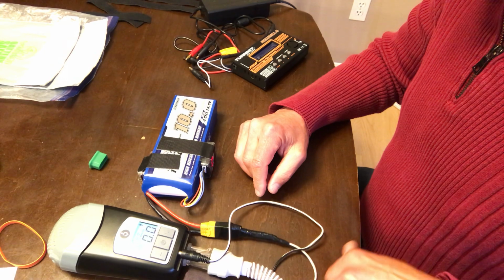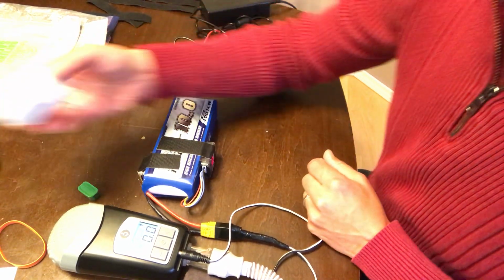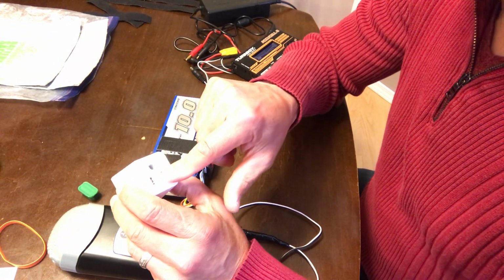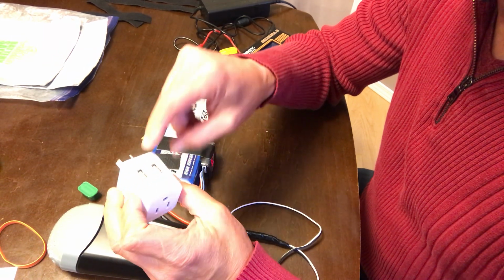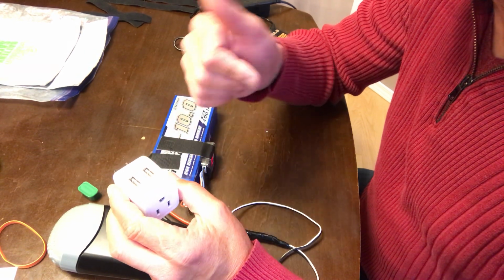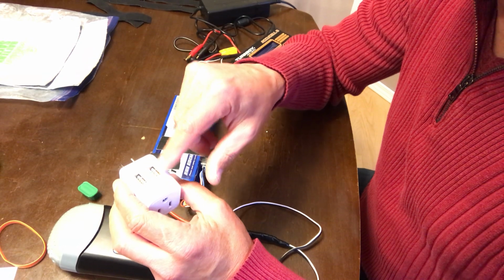The other thing I did do is since I went to New Zealand, I bought this plug on Amazon as well. So for the USA, that's your plug type. For New Zealand, that's your plug type. This is also a 220 to 110 converter, and it has 2 USB ports on top, which is fantastic for charging my phone and other things like your GPS communicator that you need to charge as well.